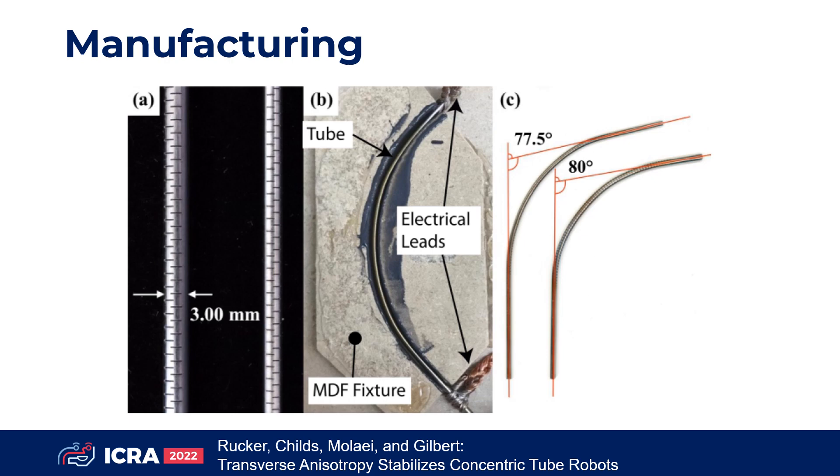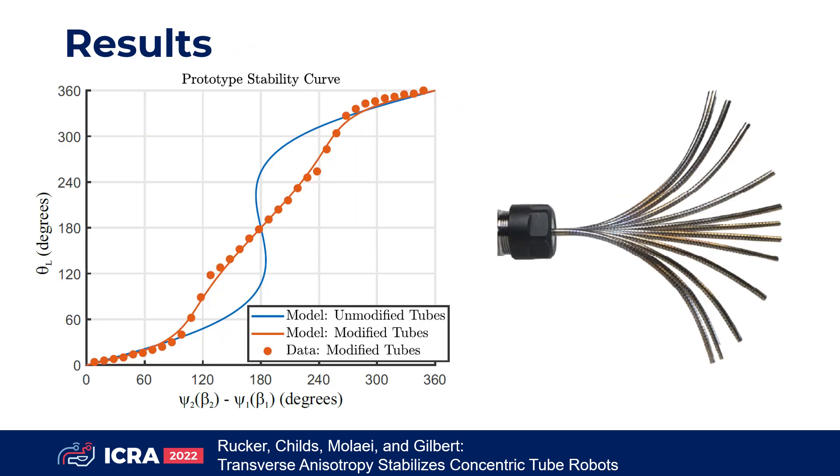To manufacture the tubes, we first laser-machined the desired cut patterns and then electrically heated the tubes to set their pre-curvatures. We experimentally measured the input-output curve and found it stable and well predicted by our generalized model. This tube pair would be unstable without the modification. The workspace of the tubes is continuous and well conditioned. Such transversely anisotropic tube designs open the door to future applications with highly curved and dexterous robots.